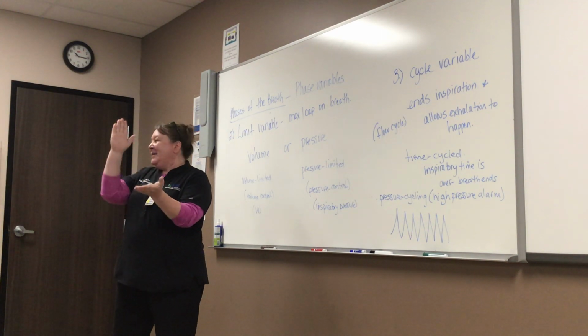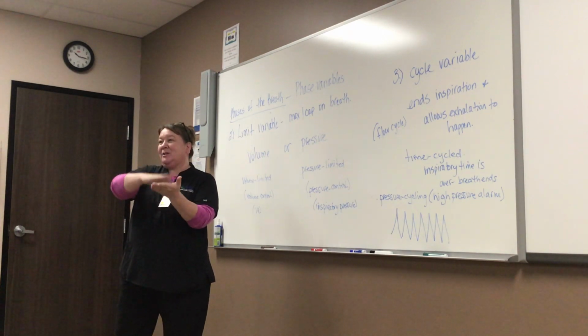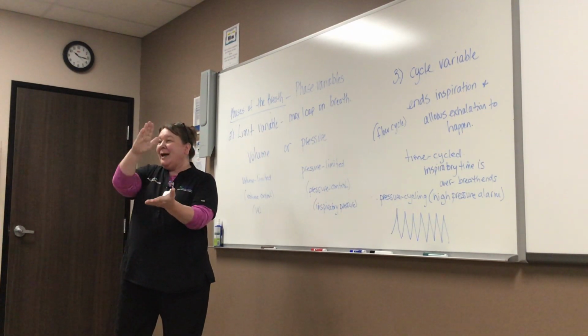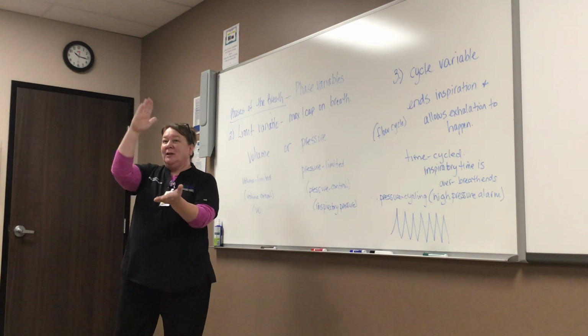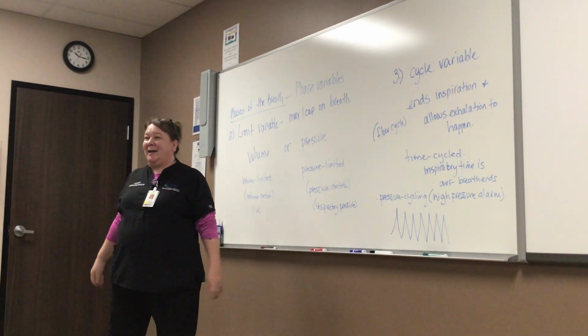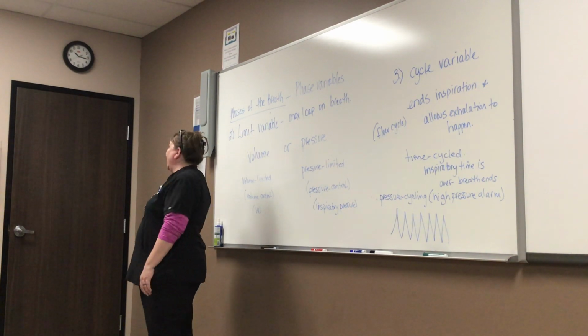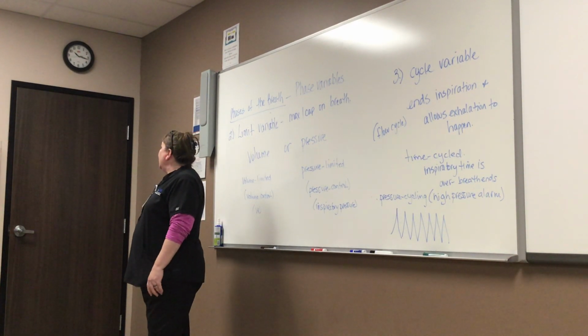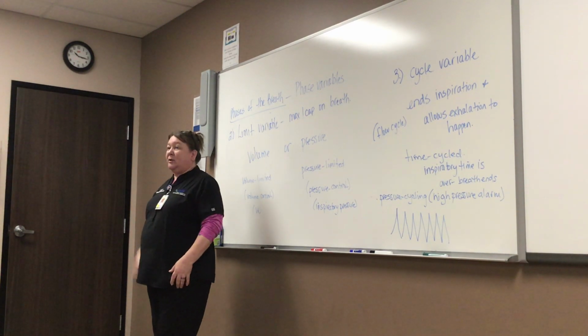Yes. Patient is on the vent in distress. Your pressure alarm's going off nonstop. What do you do first? Take them off and bag them. Then what do you do next? Try to pass a suction catheter. You're taking your boards. What do you do next? You can't pass a suction catheter. Extubate. You're in clinic. You can't pass a suction catheter. What do you do? Saline and bag. Okay. We'll do that a few more times later. Then you extubate.